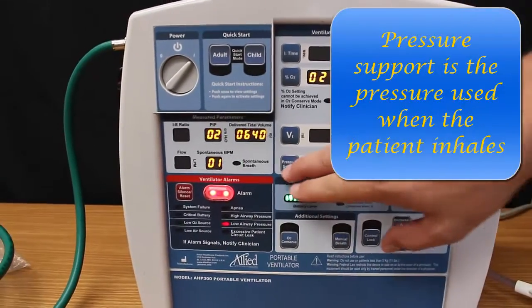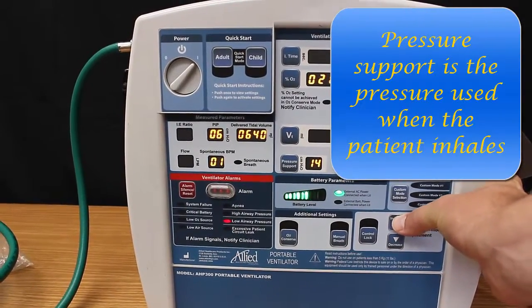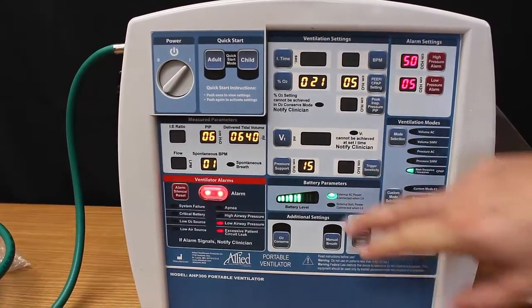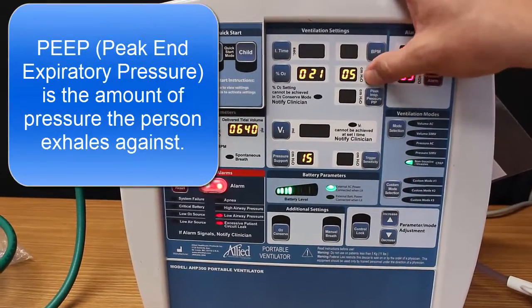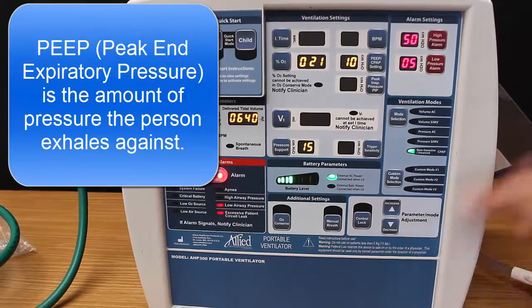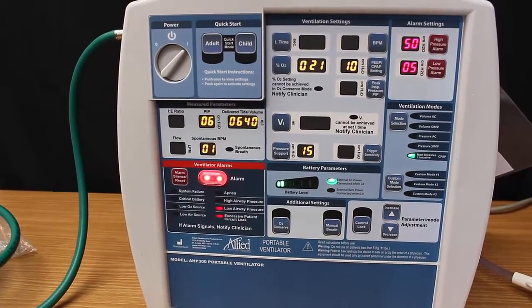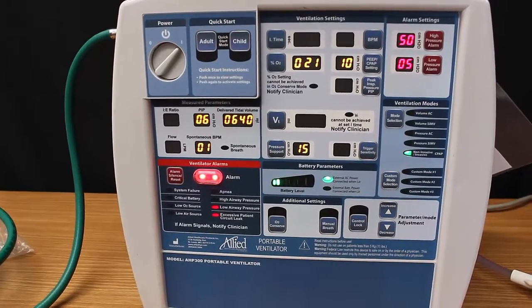Add pressure support. We have increased pressure support to 15 and a PEEP of 10. You have now achieved BiPAP ventilation with the Allied Ventilator.